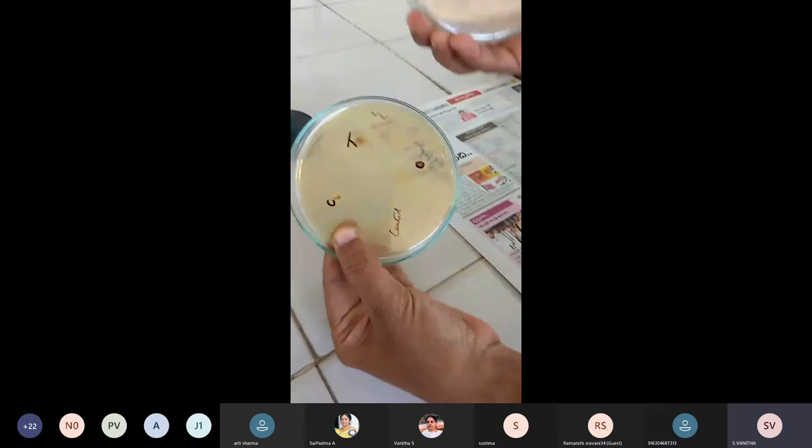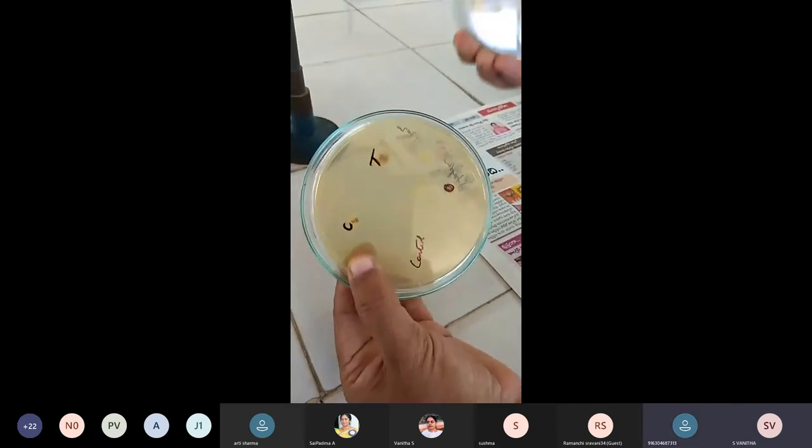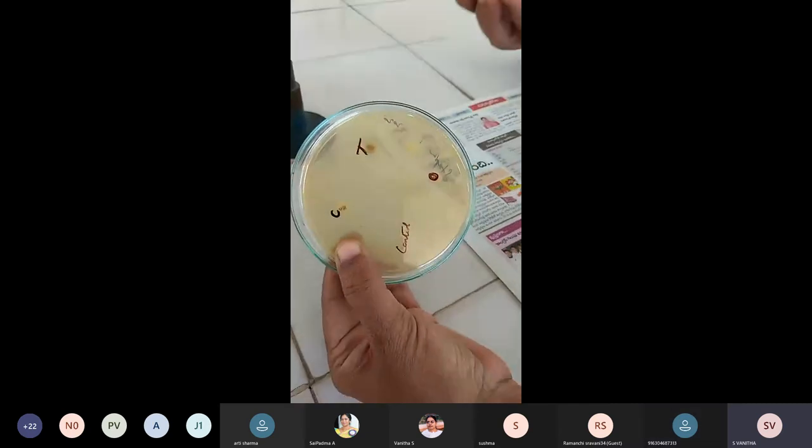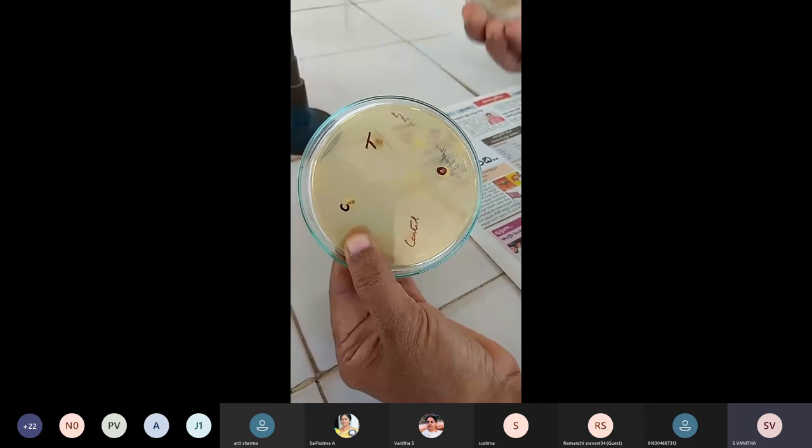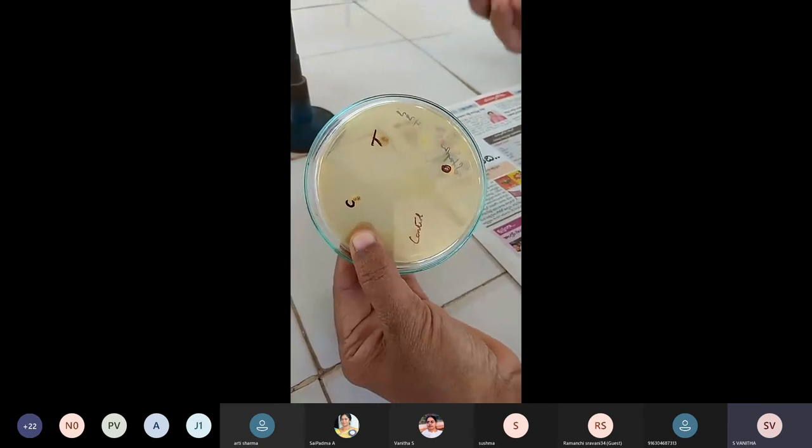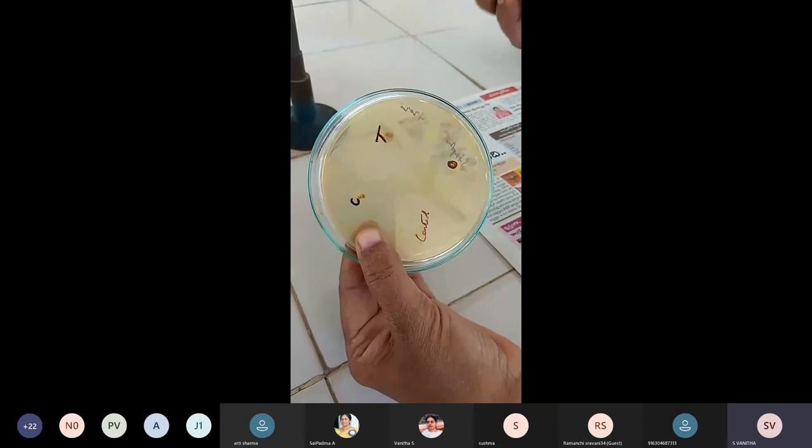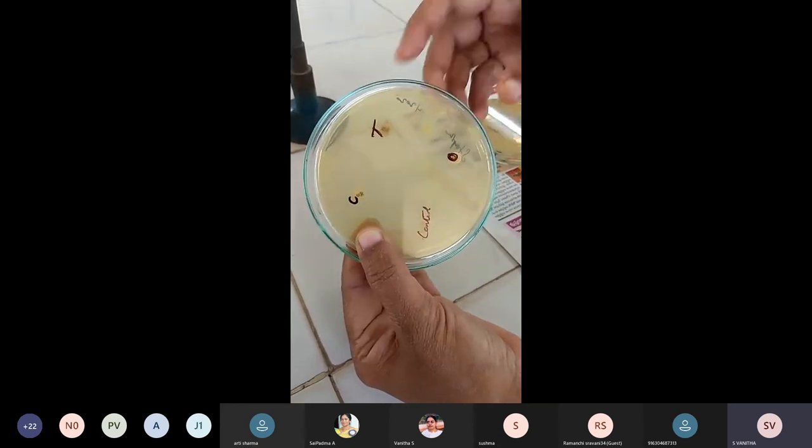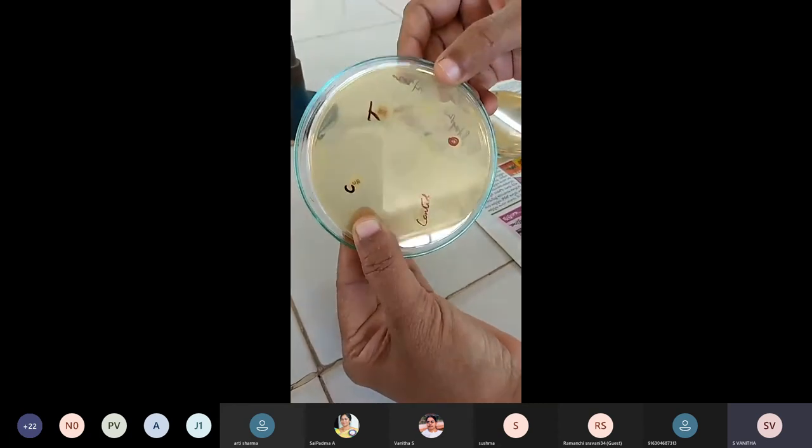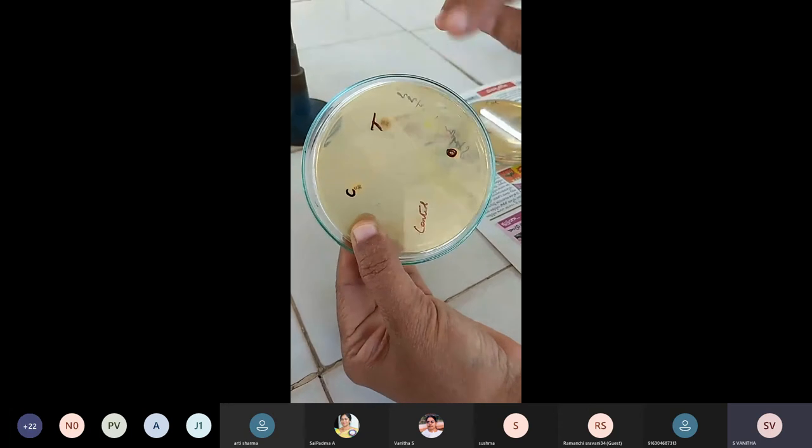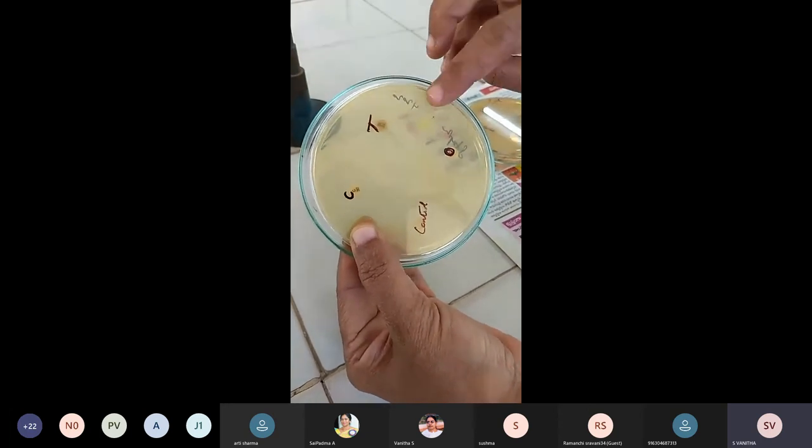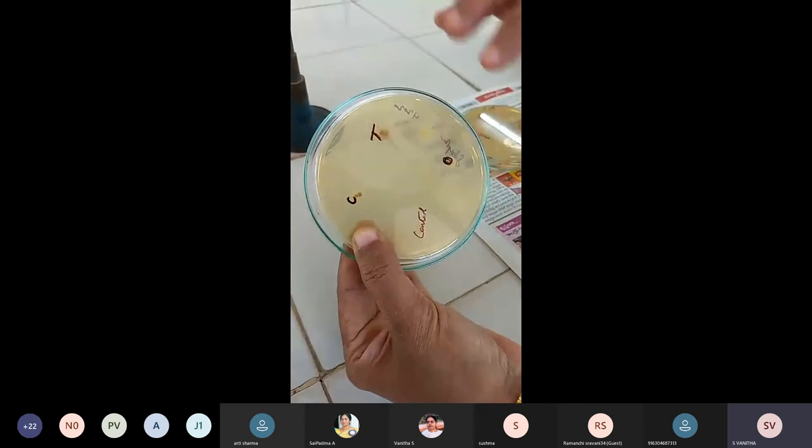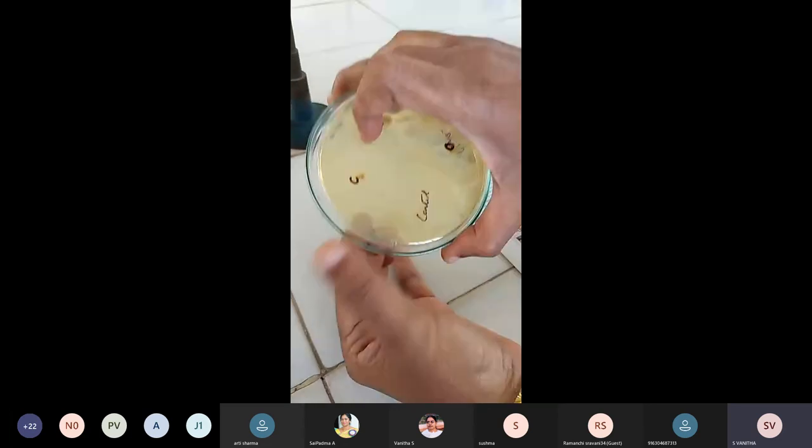Yes. Here the E. coli organism was sensitive, and all the zones I have measured are starting from 15mm only, so that means the organism is highly sensitive. But Staphylococcus, there was no zone of inhibition, so that shows that the organism is resistant to all the antibiotics.